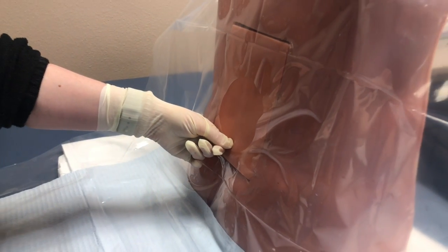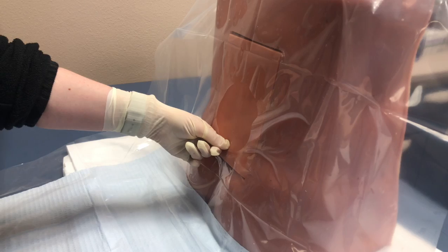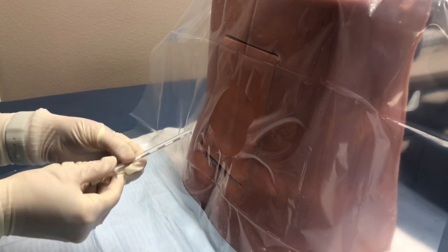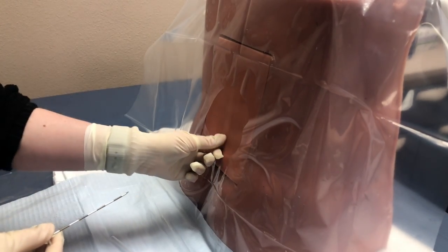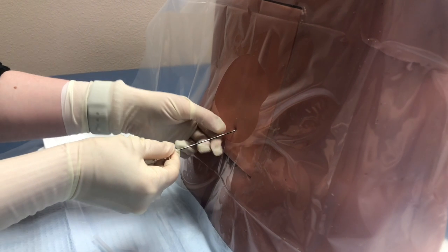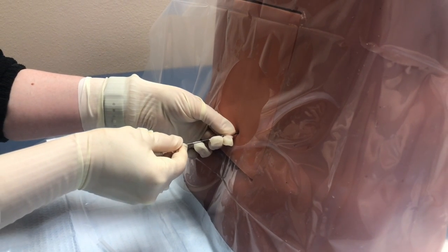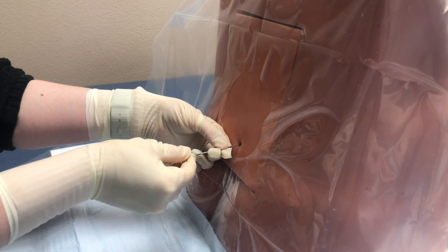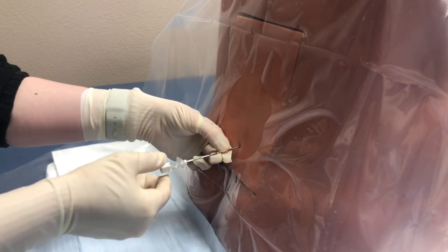Epidural needles are larger and more rigid than spinal needles, and the placement does not require an introducer. The needle is placed with the bevel up. Slowly insert the needle through the skin, subcutaneous tissue, fatty tissue, supraspinous ligament, interspinous ligament, and possibly into the ligamentum flavum. At that point, the needle should sit firmly in the midline. Remove the stylet.